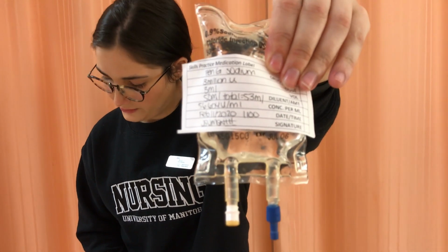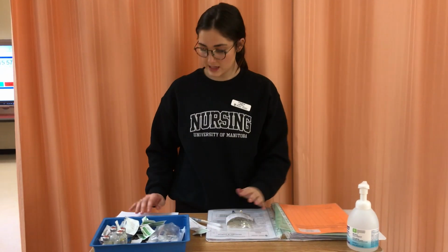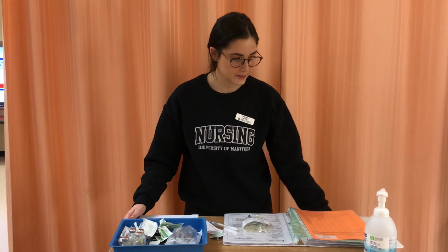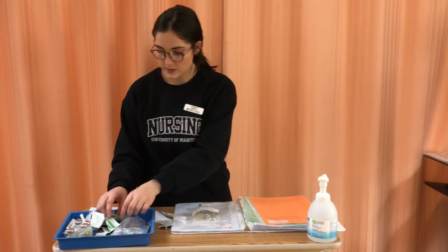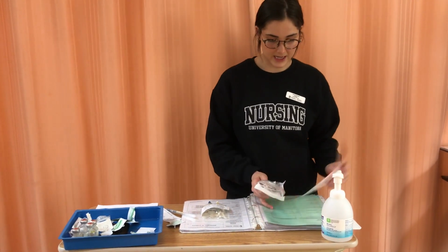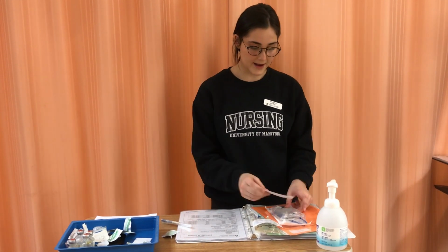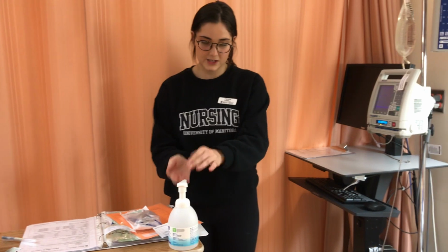And we've done the math for our flow rate, so we have a total of 53 milliliters, and we're going to give it for 15 minutes, so that means we have a total of 212 milliliters per hour. Okay, so I'm going to grab my alcohol swab, my secondary set, and my MAR with my medication, and my label for my line, and I'm going to go into the patient's room. So I'm going to knock, do hand hygiene.